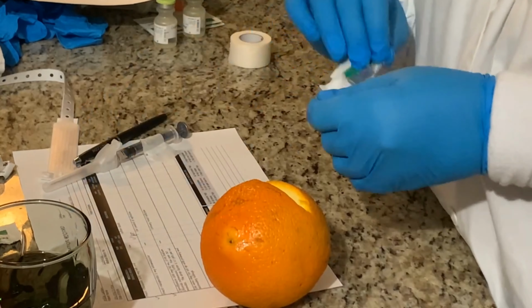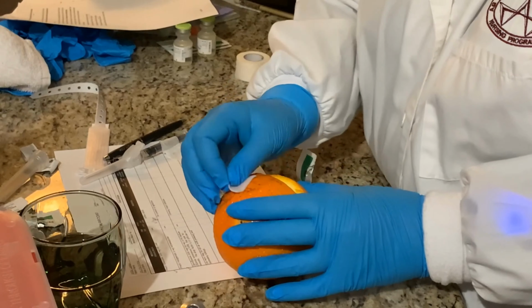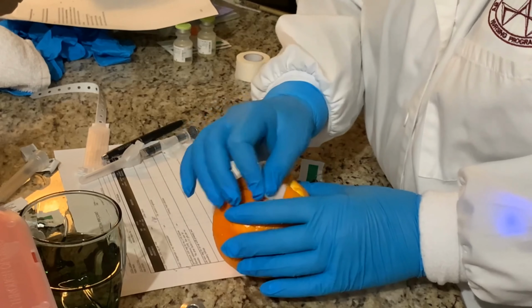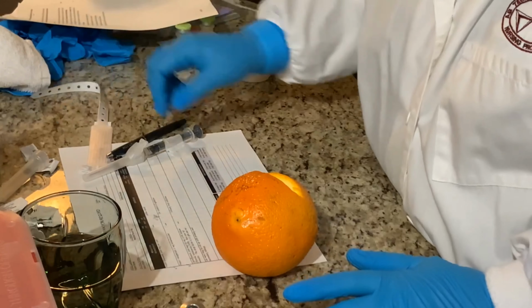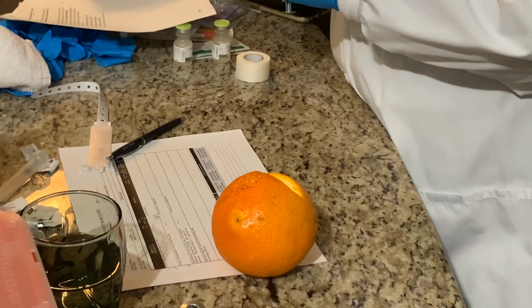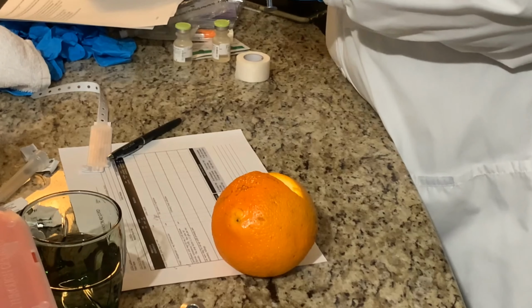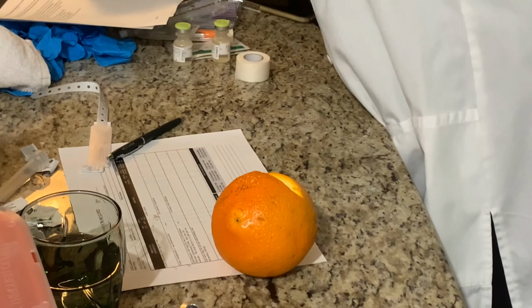I get my alcohol swab, and I'm cleaning in a circular motion from in to out. And then while that's drying, I'm going to get me a pad that I can put on top so that I can apply gentle pressure. So now I'm ready to give the injection.